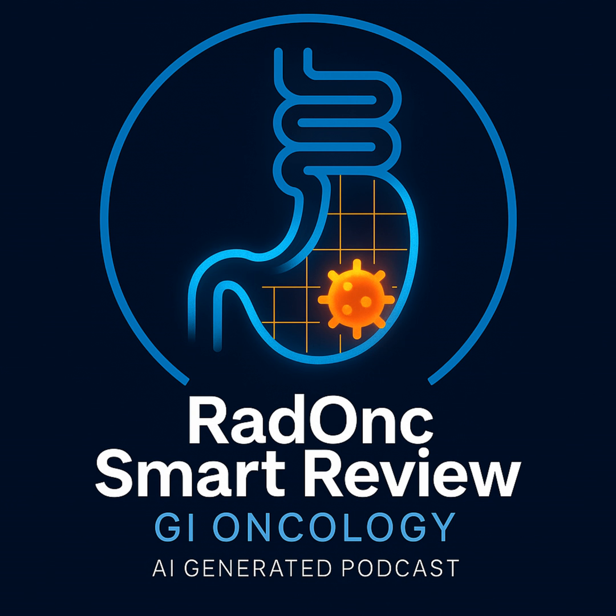That's the classic. But you mentioned IMRT earlier, and this simultaneous integrated boost, or SIB, approach. That's becoming really common, isn't it? How does that work? SIB is a very elegant and efficient way to do it, especially with IMRT or VMAT techniques. Instead of treating the 45 gray volume first, then doing a separate plan and treatment phase for the boost, you do it all at once. You deliver different doses to different target volumes simultaneously in the same fraction using a single plan.